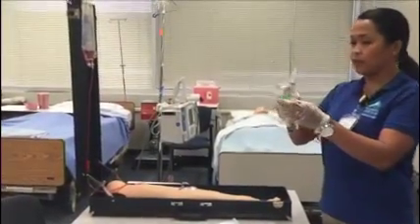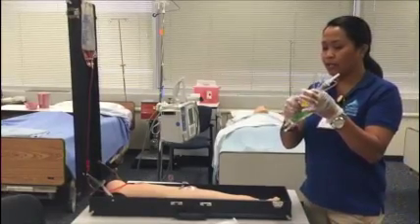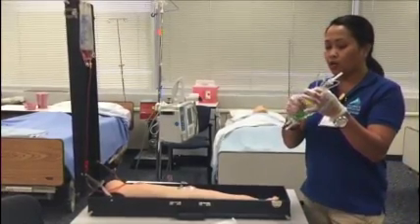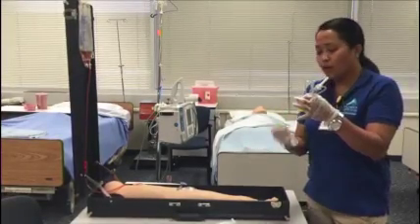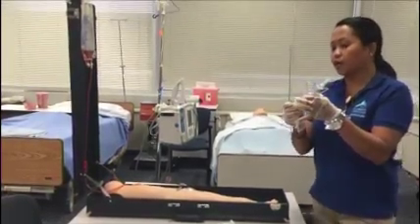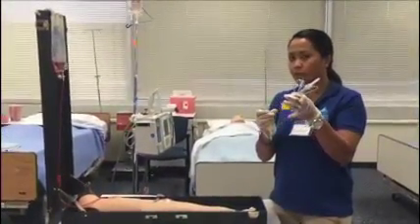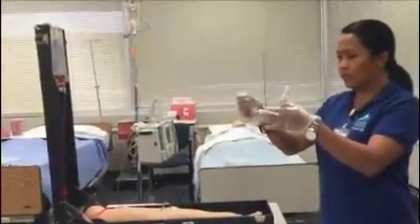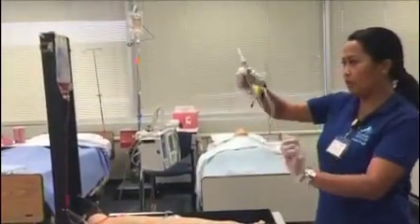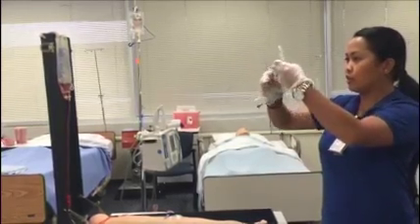I already taped the documentation on the tube, so the other nurse knows the name, the date, and the time that I'm using this tube line. All right, I'm taking the two ends of the lines to make sure this is still sterile. Make sure nothing's touching it.